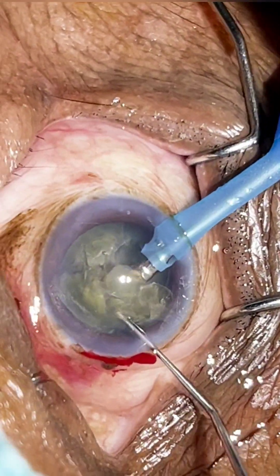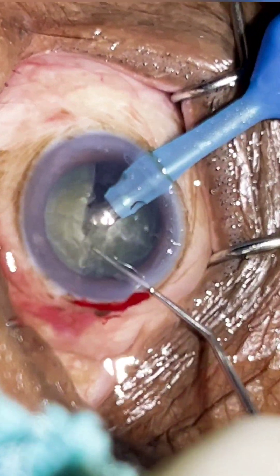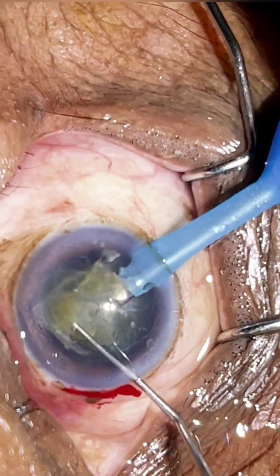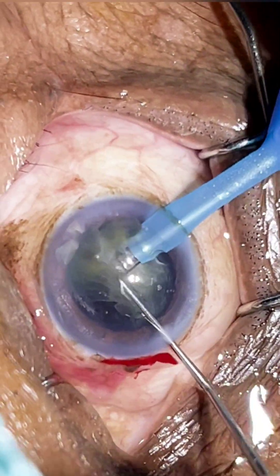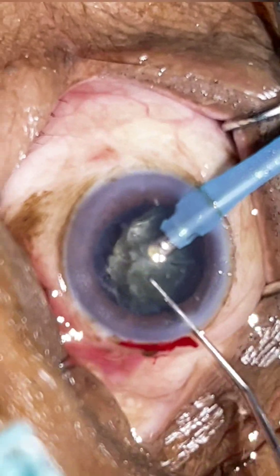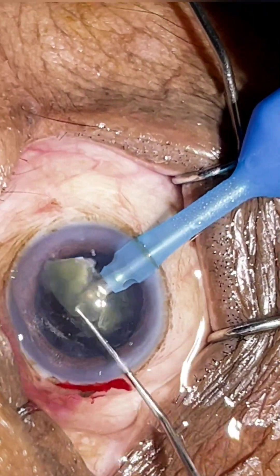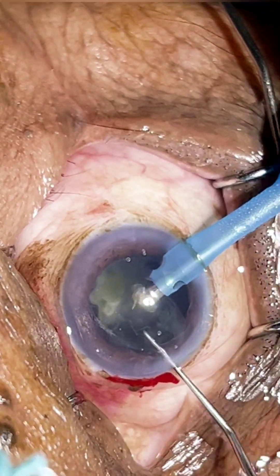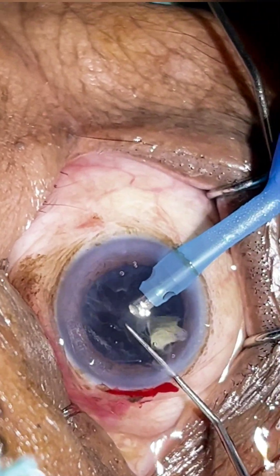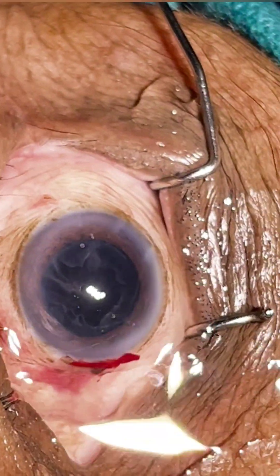I made each hemi-nucleus into smaller fragments. We are emulsifying them at the plane of the iris. Even though it is an elastic nucleus, because we have done a small groove, the chop steps became easier. For the last piece, we have to make sure the pointed part — as the last piece is usually in the shape of a triangle — does not get directed towards the posterior capsule, because it may cause PC disturbance.